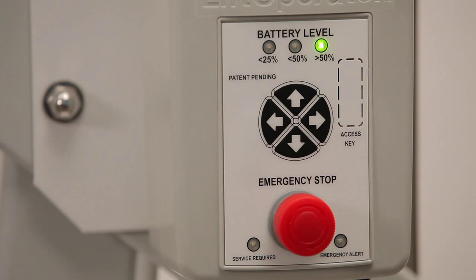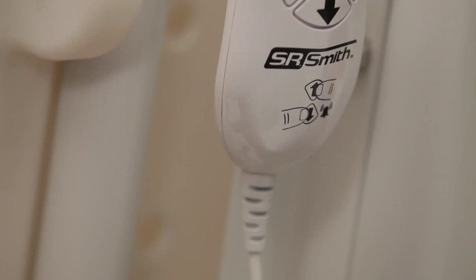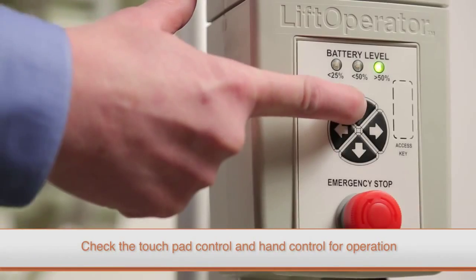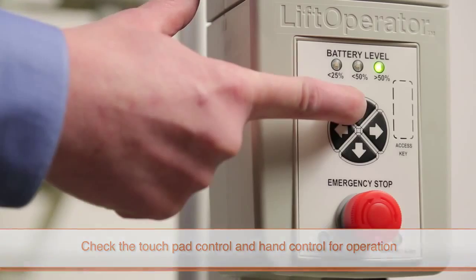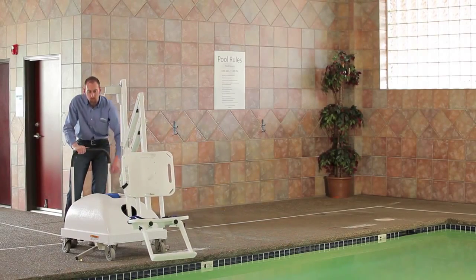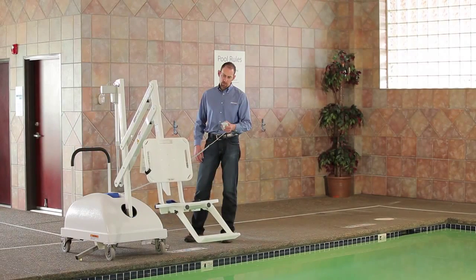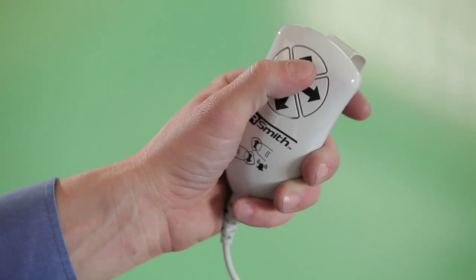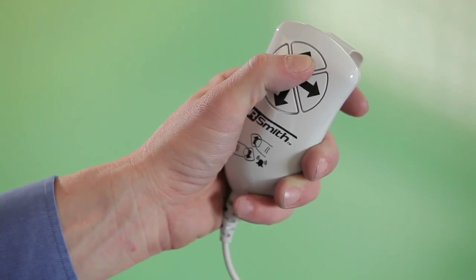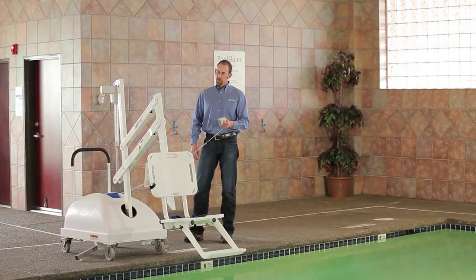If the battery pack is fully charged and the lift still does not operate, the lift controls need to be checked. First, test the functions of the touchpad by pressing the up and down and left and right control buttons. If the lift operates correctly, test the functions of the hand control by pressing the up and down and left and right control buttons on the hand control. If the lift does not operate correctly, the hand control may need to be replaced.